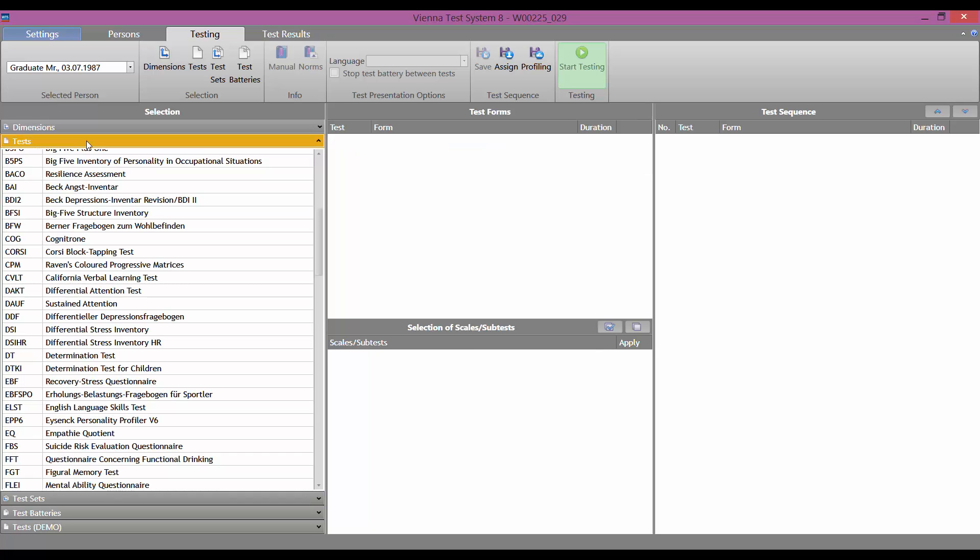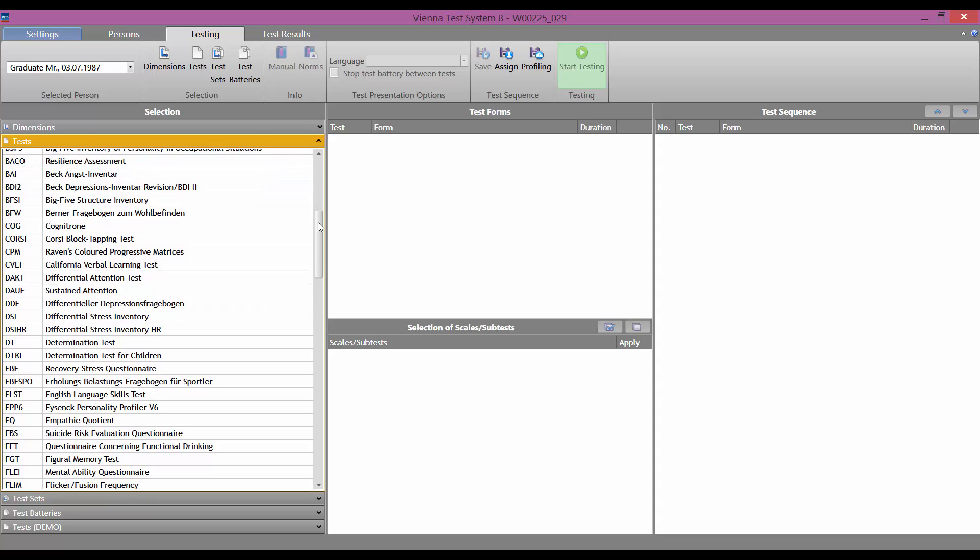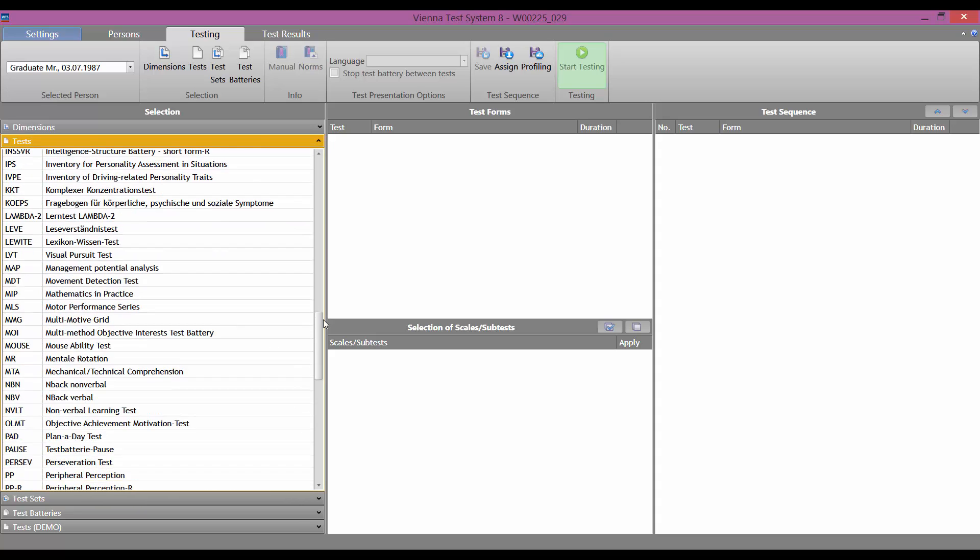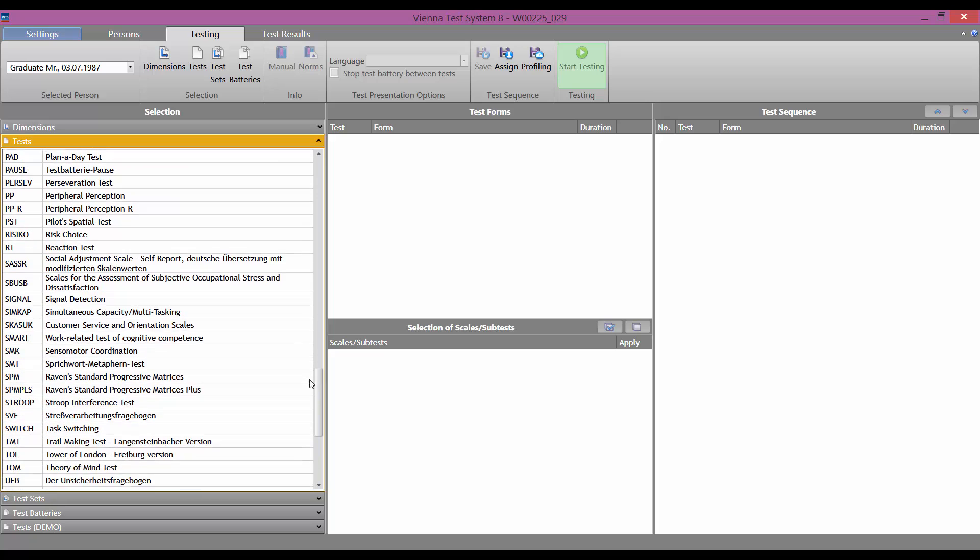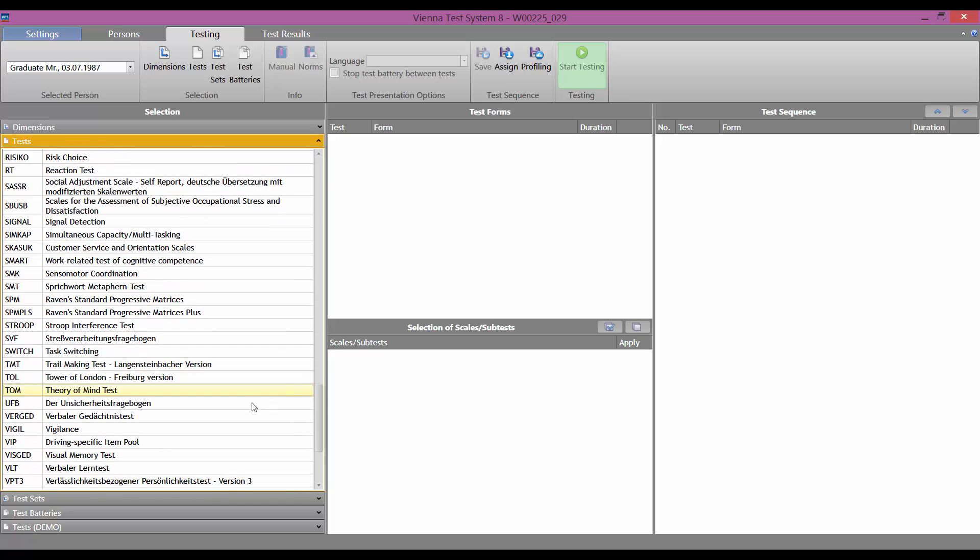We are now going to present the test Tower of London Freiburg version. Its short name is TOL. So we click on this test in the left-hand column, in the tests sub-menu.